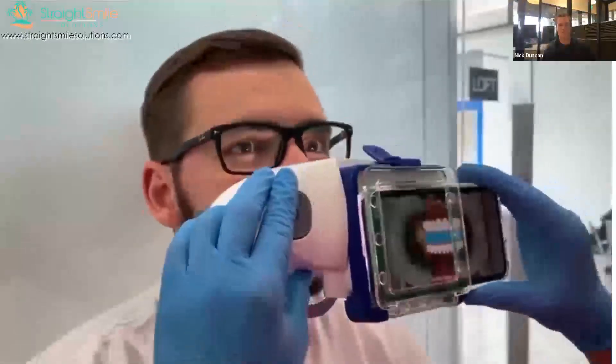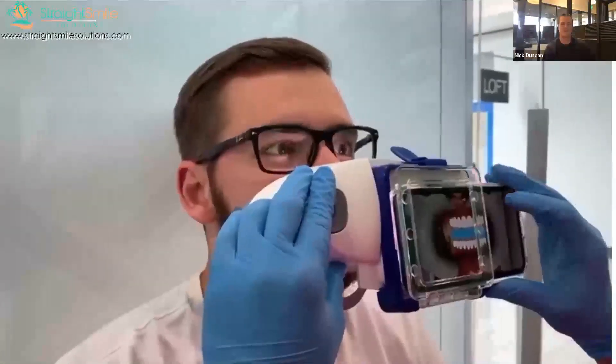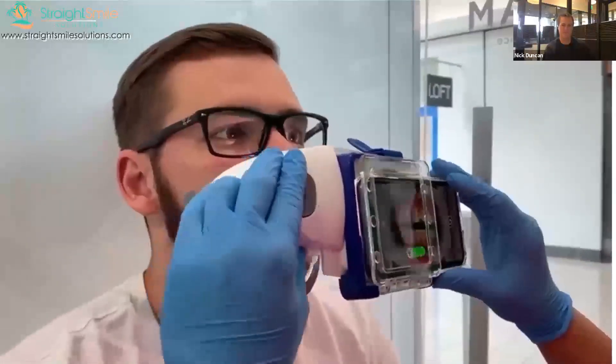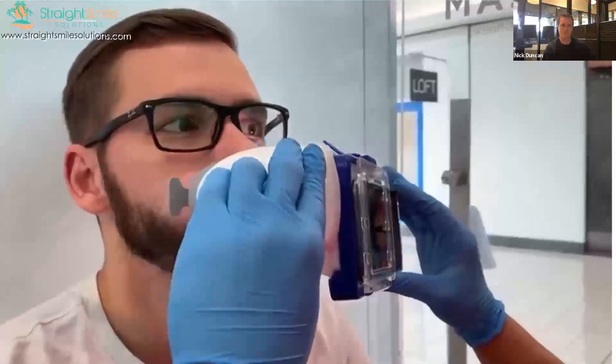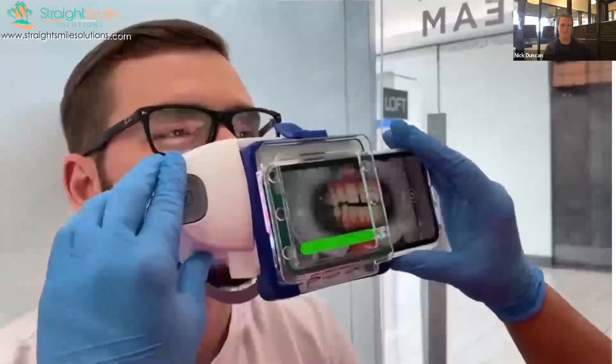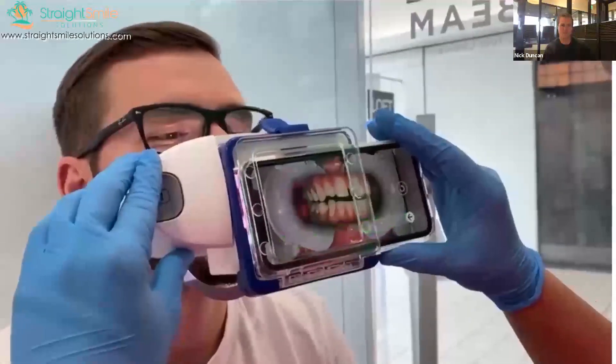For this next step you'll have to keep your mouth slightly open and keep your teeth apart. Shift the scan box to one side, then move the scan box to the other side.